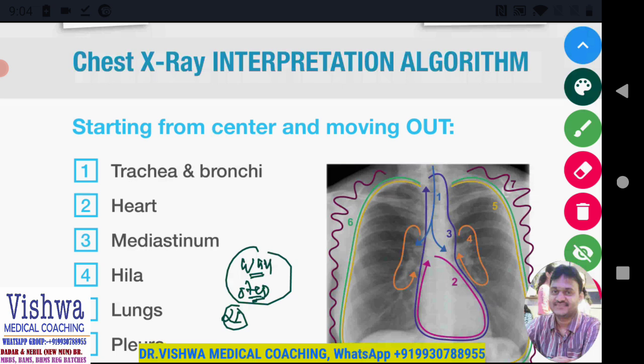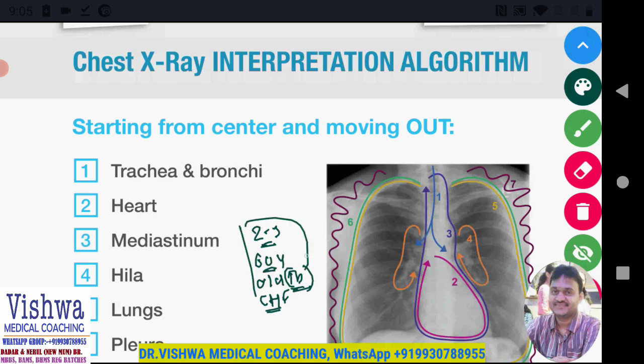Because many times what happens is, if you are looking at an X-ray, you find some pathology, let's say, and immediately you jump to the diagnosis, that this could be it. But there is a possibility that the patient can have maybe 2 or 3 pathologies in the same X-ray. If the patient's age is more than 60 years, has an old history of tuberculosis, or maybe congestive heart failure, or any chest pathology, let's say for example a patient is a case of COPD, there are a lot of pathological findings which may be there in the X-ray, which may not be important or relevant right now.